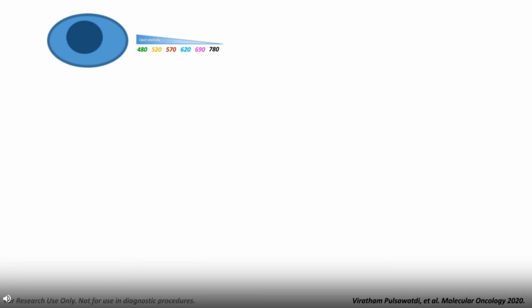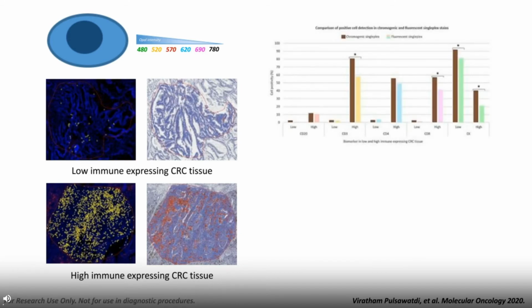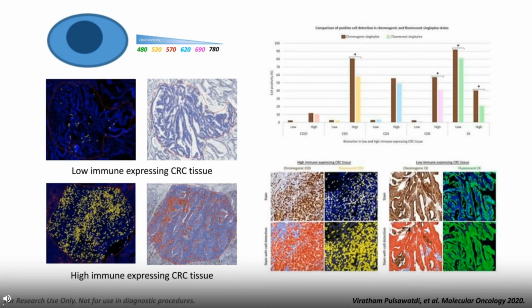So once we've decided, based on what we've done with the IHC, what was the best order and how we're going to pair them with these fluorophores, we then conducted this assessment in the same tissues and compared it directly to our IHC assessment previously. And as you can see here, most of the fluorophores matched up pretty well to their previous DAB staining iterations. However, for some, there were significant differences. But when we look at these more closely, it's either the result of it being from a non-serial section or due to poor cell detection in the DAB immunohistochemistry.